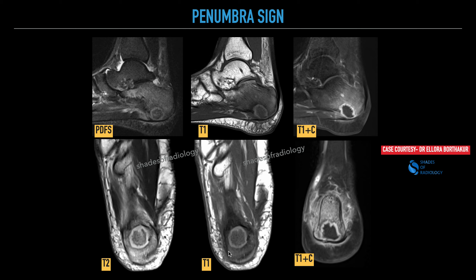You can see the similar lesion on T2 weighted sequence as well, and on post-contrast images you can see an enhancing thick rim within the lesion which is T1 hyperintense on the plain sequence, showing significant enhancement with adjacent marrow edema.